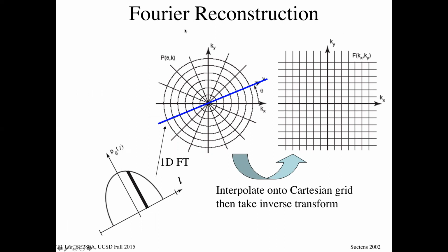So now that we have the projection slice theorem, we know how to map our raw data into Fourier space. Our raw data, remember, is we have a detector with 1,000 elements. We take a shot, we get a picture that's g_l(theta), move to another theta, get another one. So I have this sinogram.